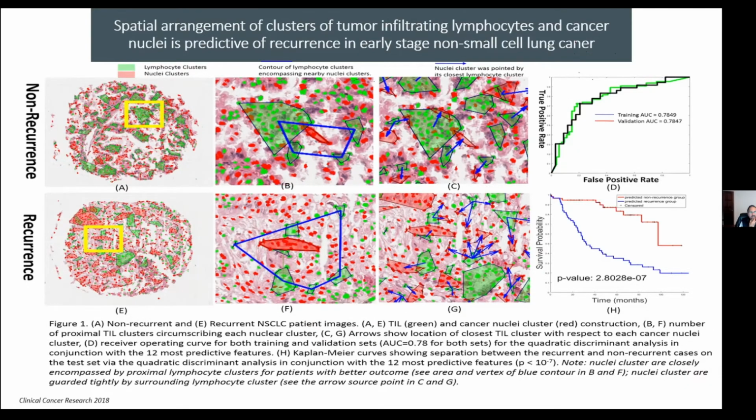And we studied this in the context of lung cancer. And so we trained our machine learning to go in and identify immune cells, and you can see these in the green cluster here, and also the cancer cells, and this is in the red cluster.